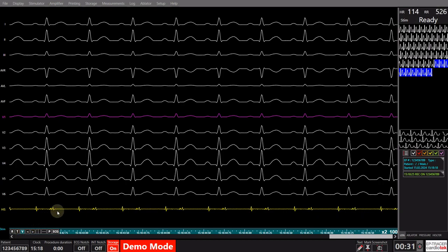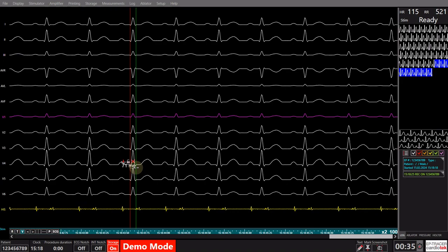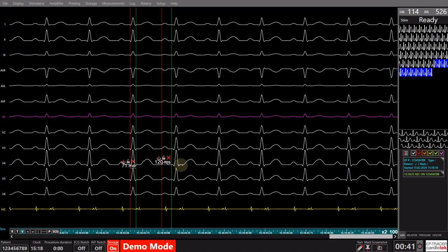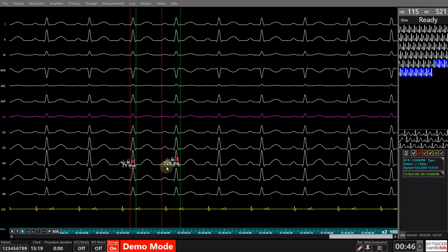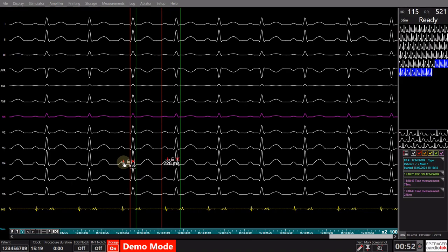When in view mode, left-click at the desired location, and while holding down the mouse button, drag the cursor to the appropriate spot to perform the measurement. Once measurements are completed, you have the option to store the calipers in the intervention log if applicable. Alternatively, seamlessly return to real-time mode by clicking the R button on the screen.